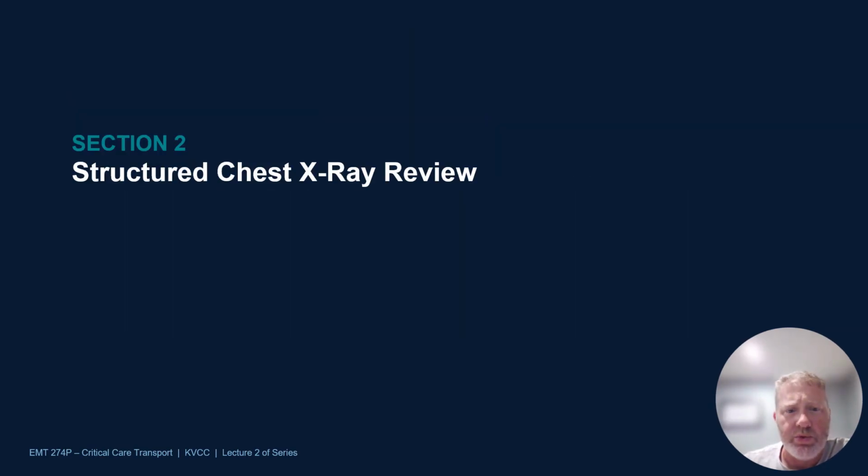Let's go through a repeatable approach that you can take rather than a memorized list of what different diagnoses look like. That can help to lower the error rates when taking a look at them, especially when you're tired and hurried and stressed.